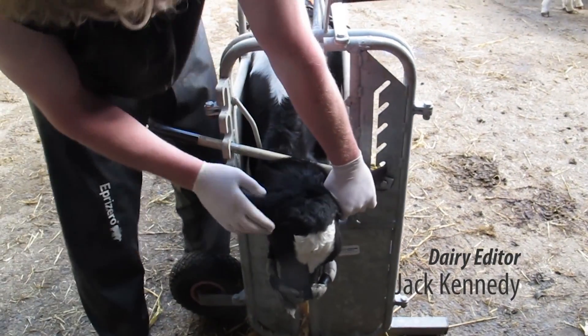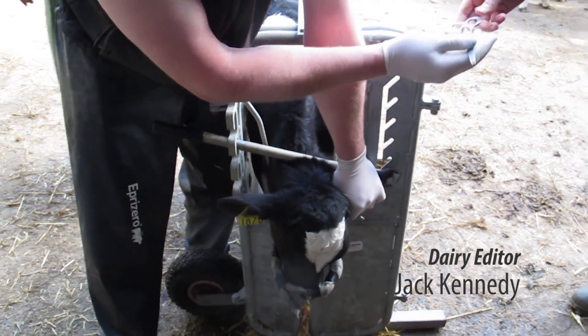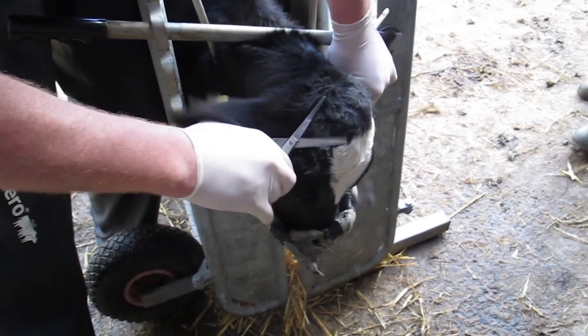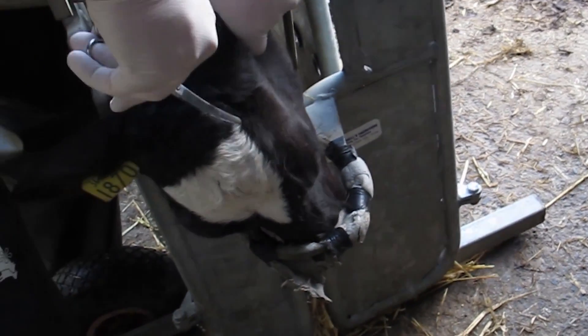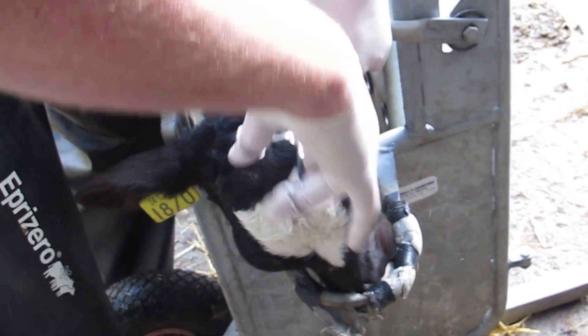Dehorning young calves is highly beneficial from both a welfare and economic standpoint, and doing it properly can make it easier for the calf and the operator. I met up with vet Tom Julian as he dehorns some calves to see how he does it first hand.